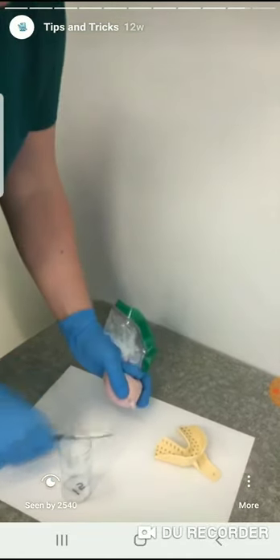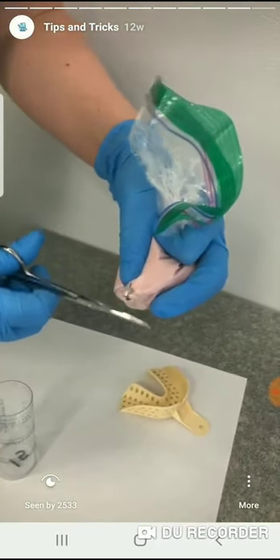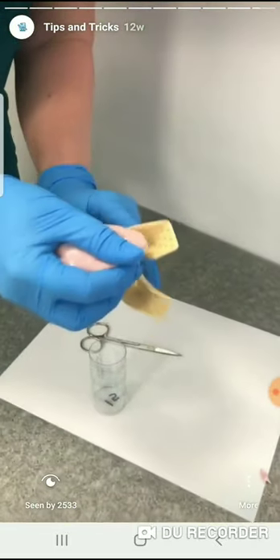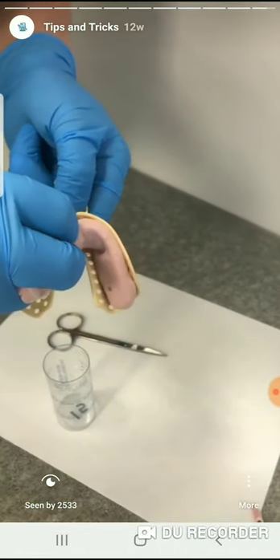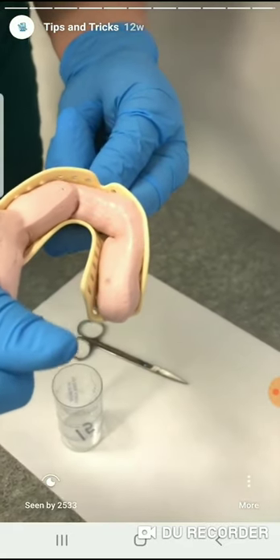Then cut off that little end that you're holding, and what's nice is it creates a little piping bag for your alginate. You just squish it out in a U-shape.